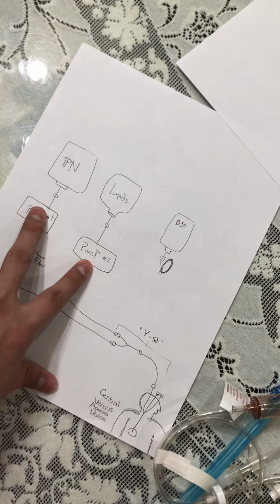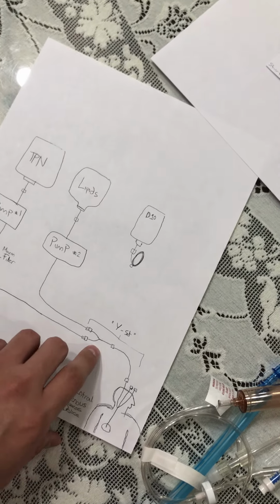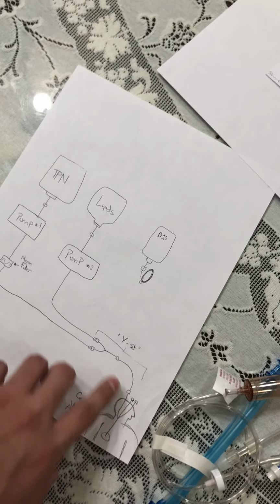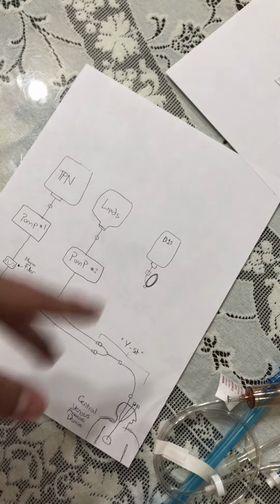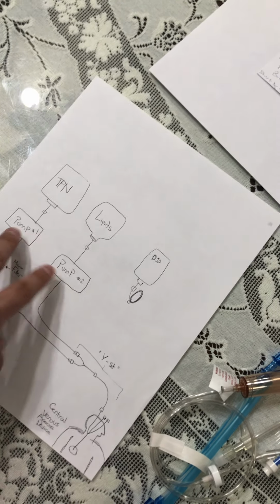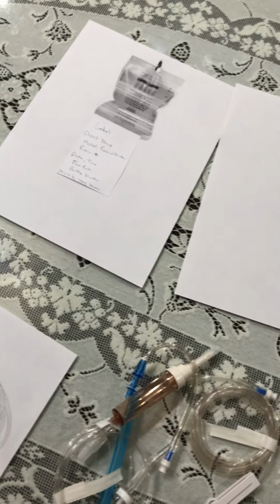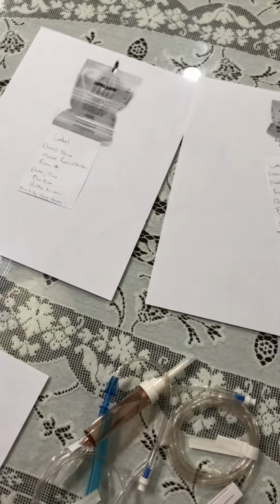So I want to designate each solution to a pump, connect it to the Y tubing, and connect it to the central access device. And then I want to do my checks with the doctor's order and program the proper flow rates to each pump. So after I do that, I believe that the TPN and lipid administration is up and running.